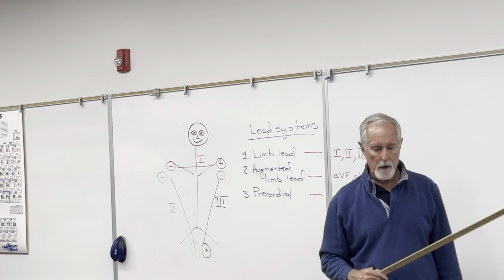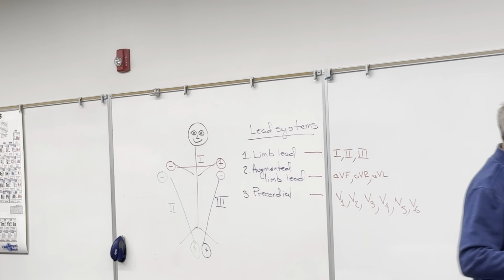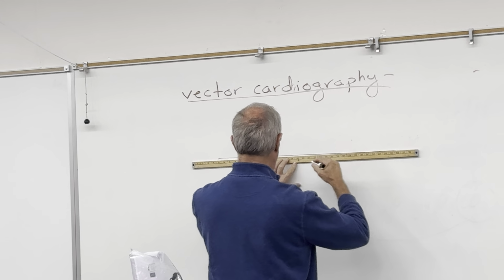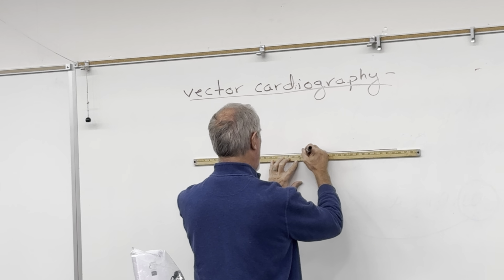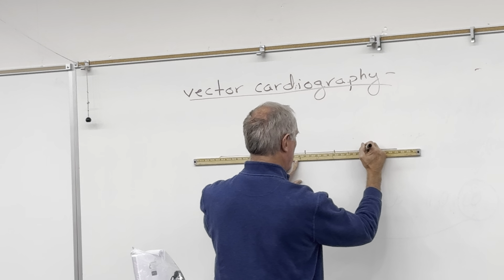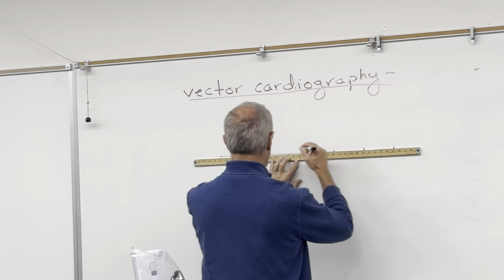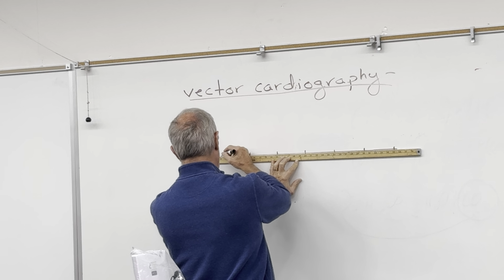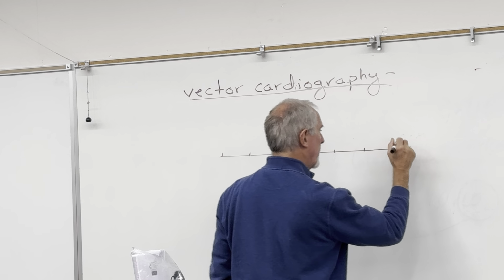Watch what I'm going to do with these now. Here's going to be lead 1.